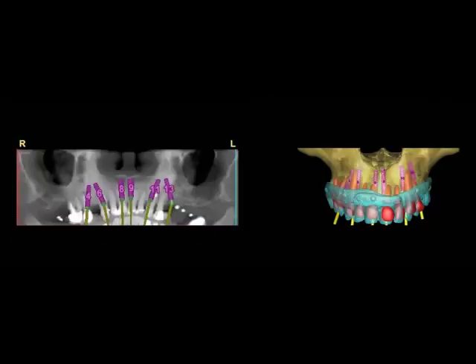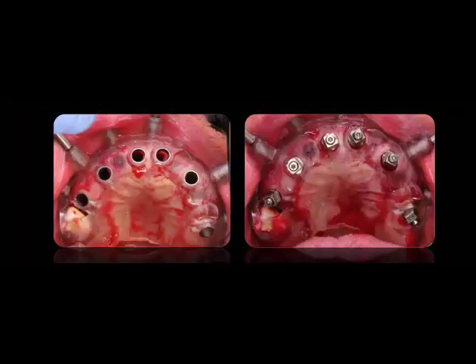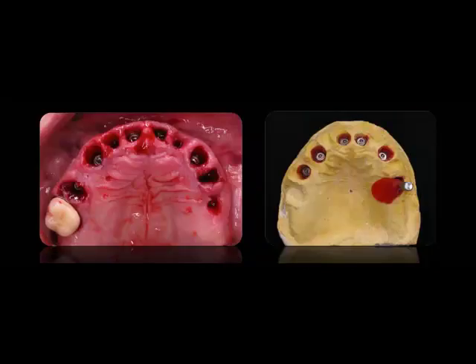What we have now is his plan. We have one tilted implant, number 13, to avoid a sinus graft or angular implant, and then all the other implants are placed into extraction sockets. So we've taken great care of removing these teeth atraumatically and left tooth number 3 to help support our surgical template, as you can see, and then we placed our 6 implants. The 6 implants were placed, 5 of them were loaded. One of them, tooth number 11, the root was about 16 millimeters long, and we weren't able to get as good a stability, so we used 5 implants.